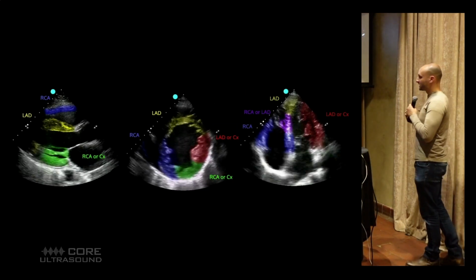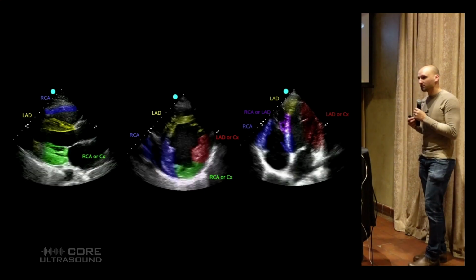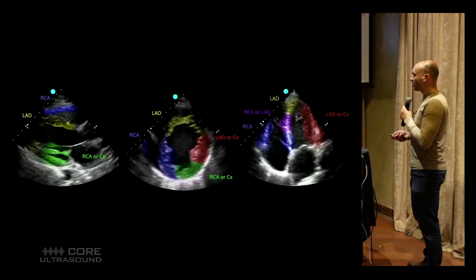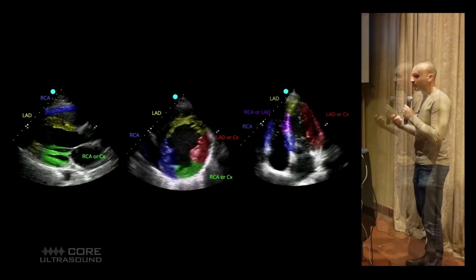This right here is something that we have on our website. My friend Ben made it, and basically shows the distributions, but you can just kind of think about them as where the blood vessels of the heart should go to be able to estimate where that regional wall motion abnormality is, where that MI is.